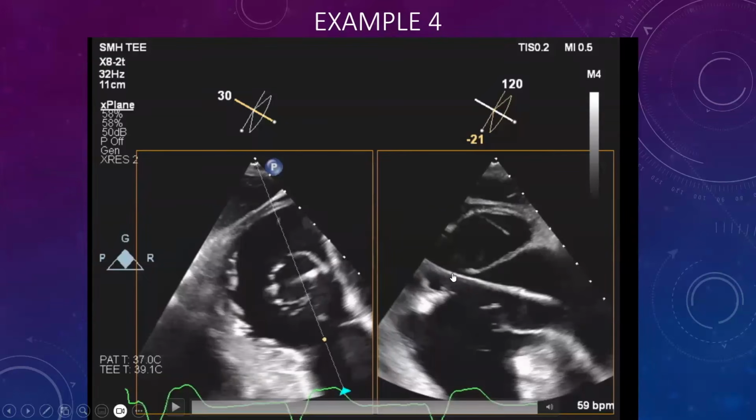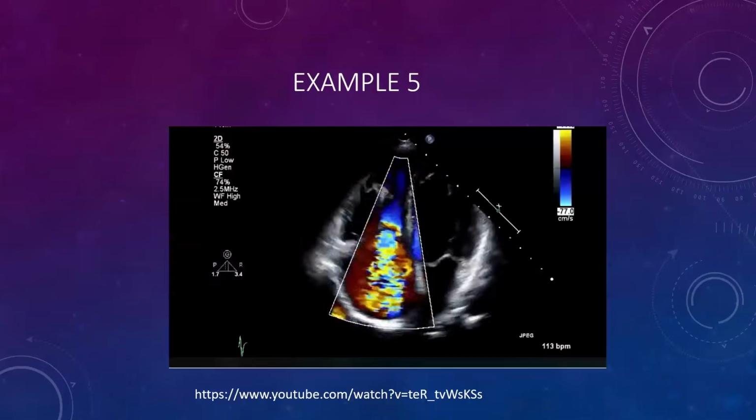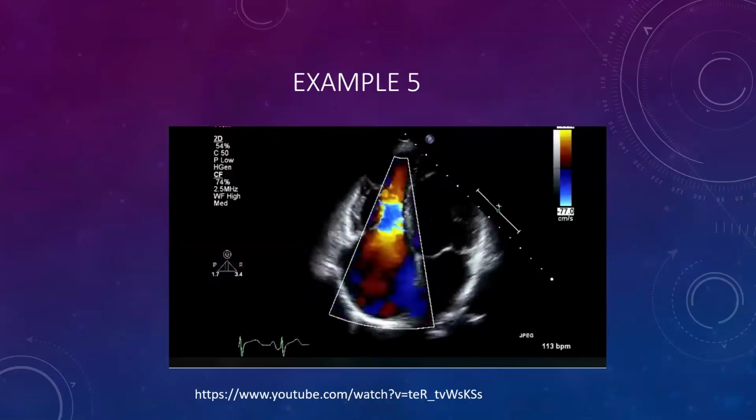Part of this tethering, I think, is because of ventricular remodeling, but also part of it is that this pacemaker lead is going through and further tethering the subvalvular apparatus down. That's a good example of how, at the end stage, there's usually multiple components. It's difficult to sort out. It's a vicious cycle, like I said.